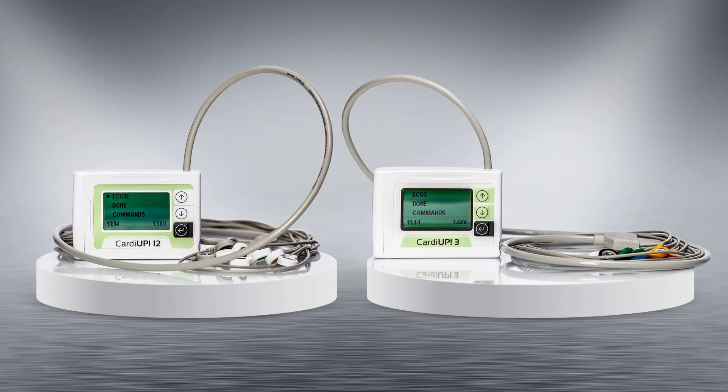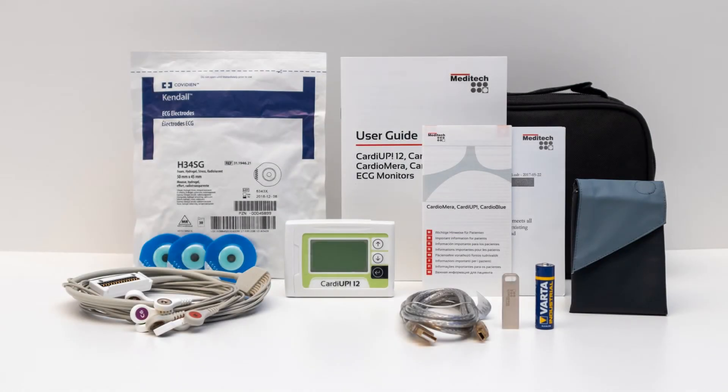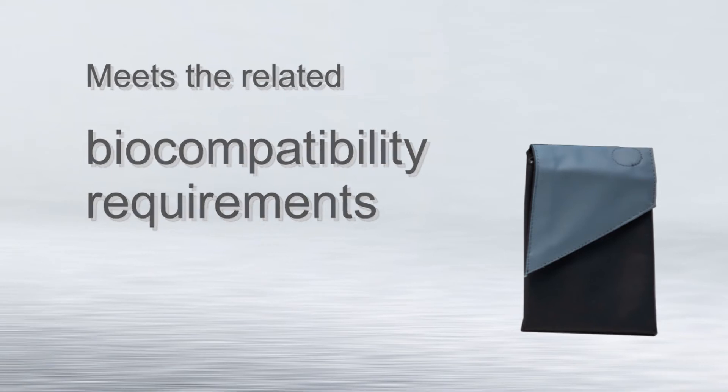Both units provide full disclosure recording for up to 7 days, so you won't miss a bit. The suitable carrying case is not only easy to clean and comfortable to wear, but its fabric also meets the related biocompatibility requirements.